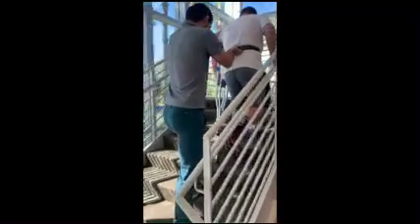Go ahead. Let's get the device down. Thank you. Good. Get the device down. Good. And then you can bring both the device back into your right hand. We're going to do a wide turn. We're going to come all the way up onto the landing. Very good. I'm going to stay here, kind of like our normal gait training. And then you can go ahead, pause right there for the patient.